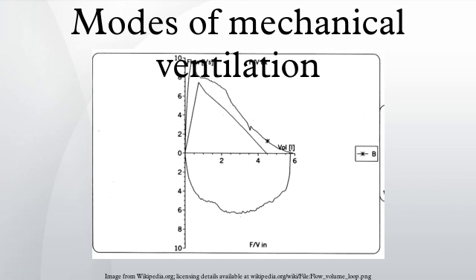Partial liquid ventilation. In partial liquid ventilation, the lungs are slowly filled with a volume of PFC equivalent or close to the FRC during gas ventilation. The PFC within the lungs is oxygenated and carbon dioxide is removed by means of gas breath cycling in the lungs by a conventional gas ventilator.